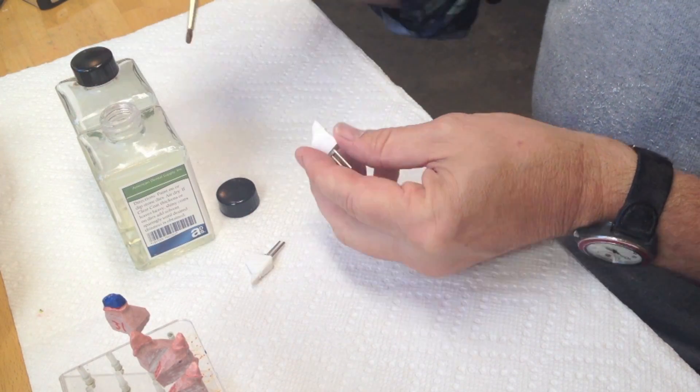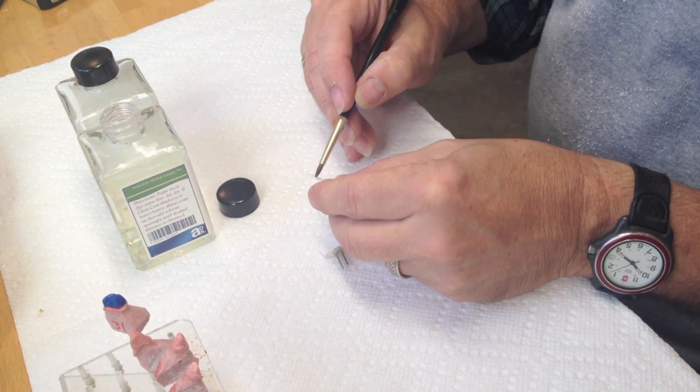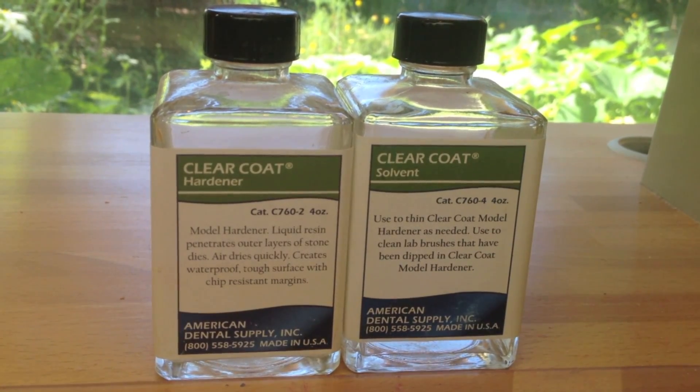One of the most important steps in making crown and bridge is the preparation of the dies. I use some steps that I have found really work over the years. The first thing I do is coat the die after I prep it with a clear coat hardener. This is a very thin hardener that I use to seal the margin.